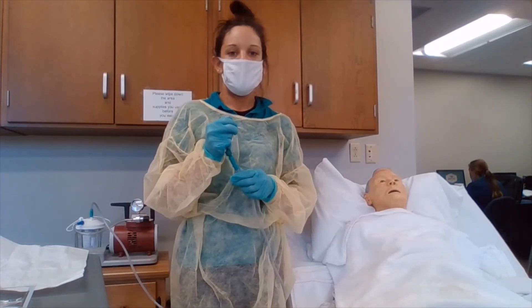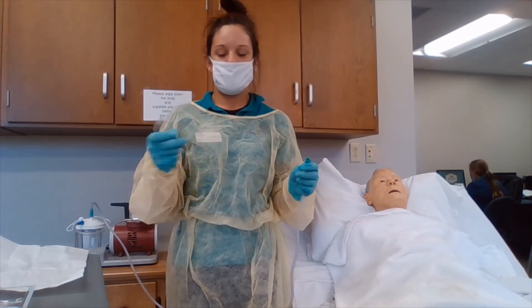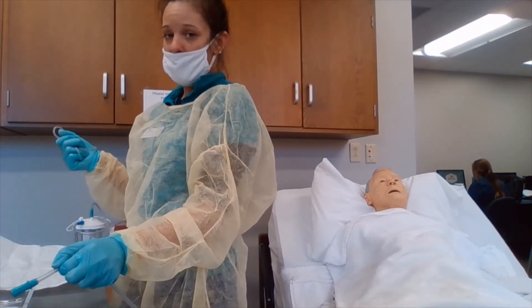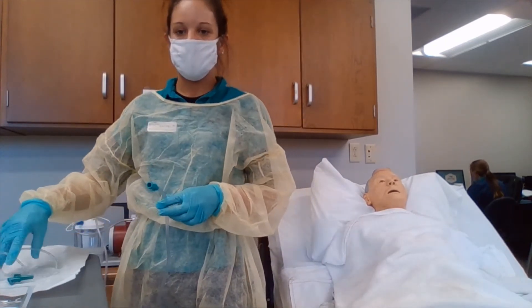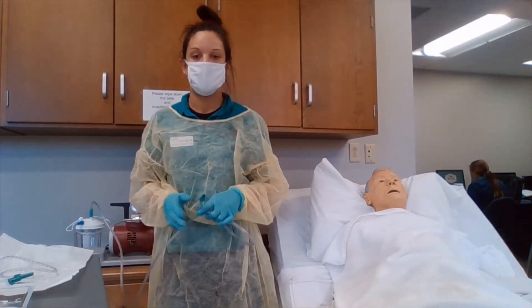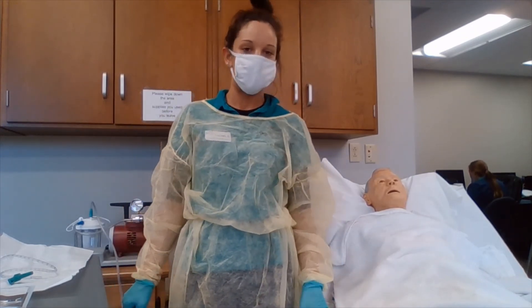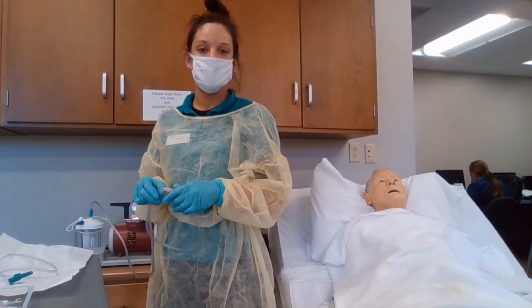When we are done suctioning, we are going to coil our catheter kit tubing, then remove it and fold our glove over the top of it. We'll use our non-dominant hand to clear the suctioning tubing with the solution. We are going to dispose of all materials properly, assess the canister to make sure we don't need a new one, and ensure we have all needed supplies for the next suctioning. We'll make sure our patient is in a comfortable position, provide mouth care, and assess their SpO2 level, color, consistency, and amount of secretion.